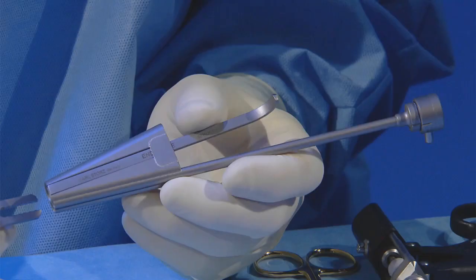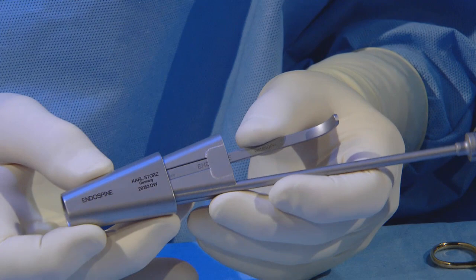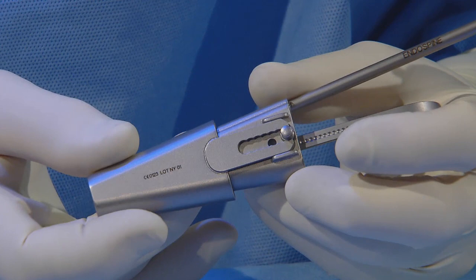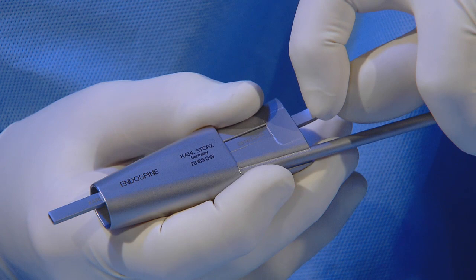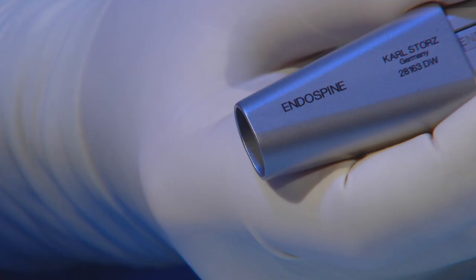The endospine system also includes a working insert which is introduced and attached to the speculum via a ratchet system. The internal part can be moved within the speculum, resulting in a zoom effect. The system also includes a nerve root retractor that can be inserted into the vertebral canal to retract the nerve.